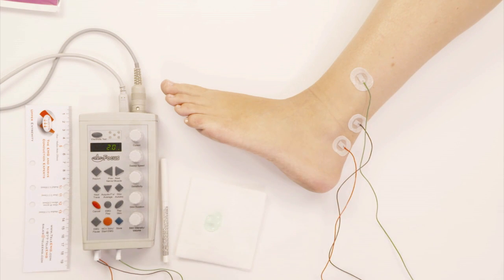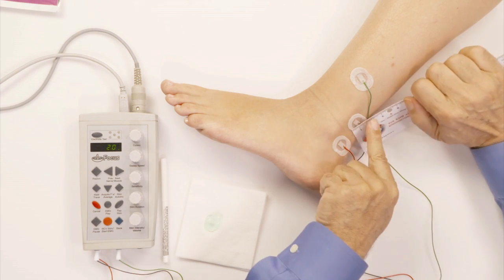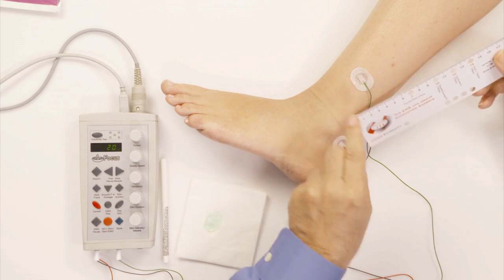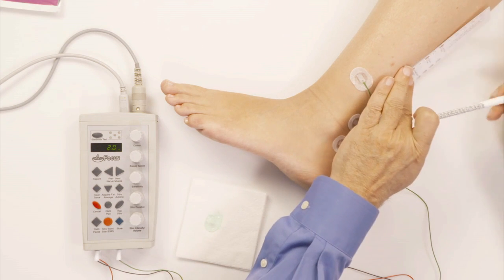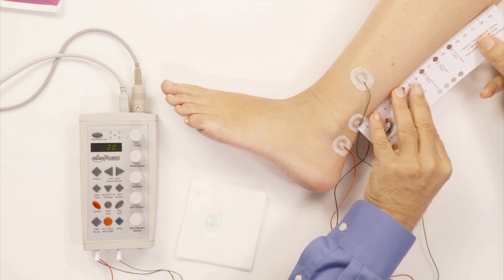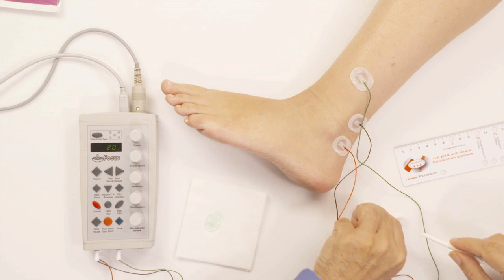Now get the stimulator ready. I have to measure from the black electrode to the back of the calf — 14 centimeters. This is the sural nerve. I measure from here to here, and from here to here is 14 centimeters. This is where I'm going to be stimulating in the back of the calf for the sural nerve.